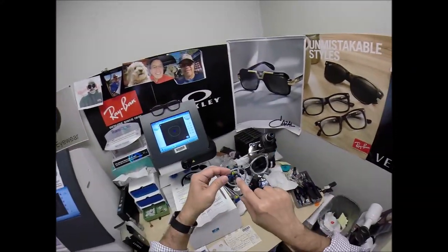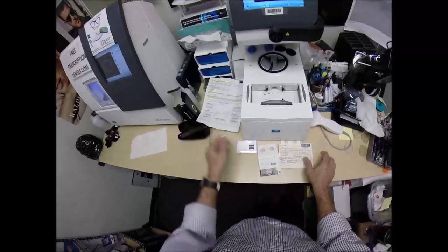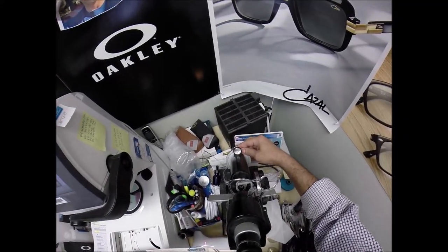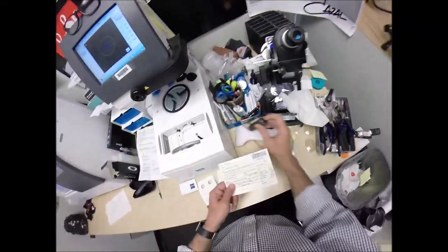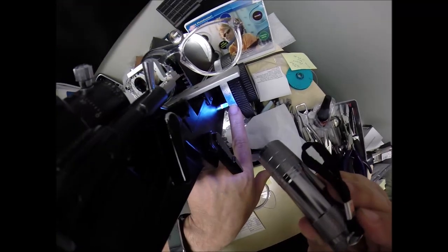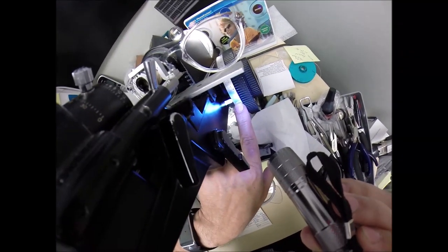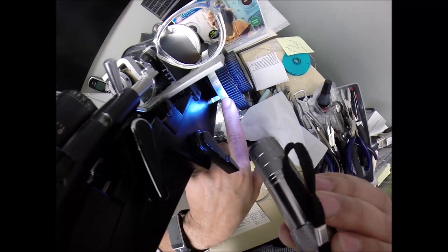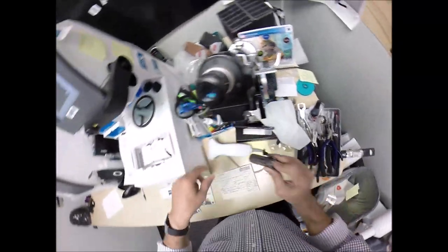So we're going to come down here to the lensometer. I'm going to put it in over that black dot. Spin the axis wheel. Turn the axis wheel to 120. Read the power, and I am getting minus one, exactly halfway between zero and two, which is where you will find one, and the red numbers are the minus. You are a myope. Hyperopes are plus numbers in black.